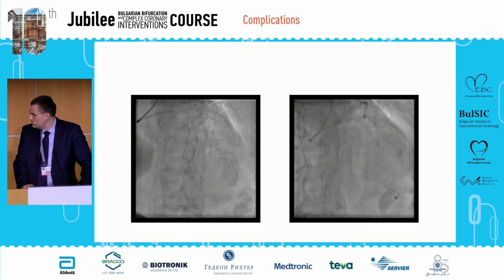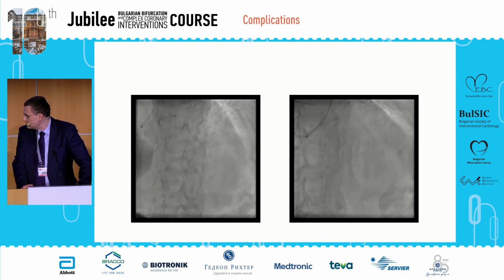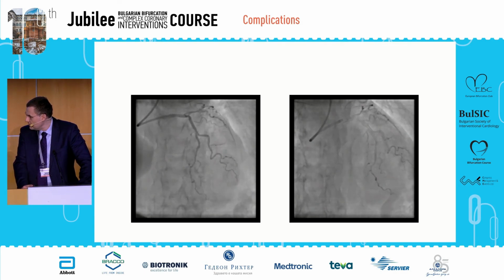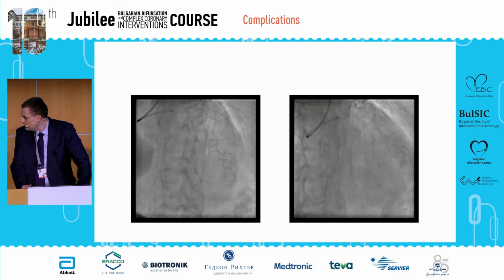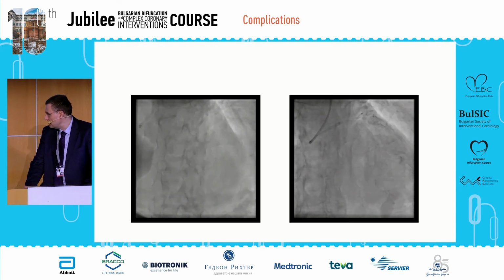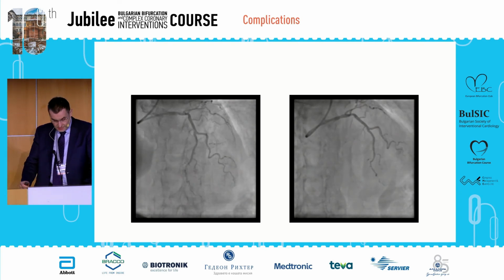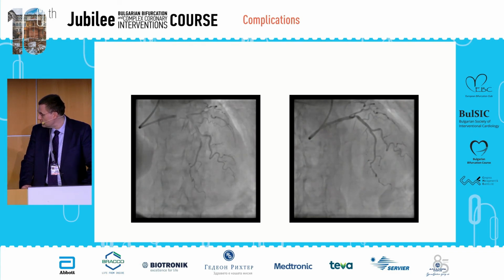It is not something special, just because of the retrograde wiring, which I think is important to know. And despite that, it uses a double lumen catheter and hydrophilic wire. Sometimes it is useful just to know and to use it.